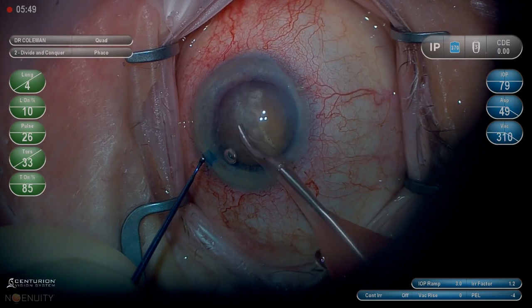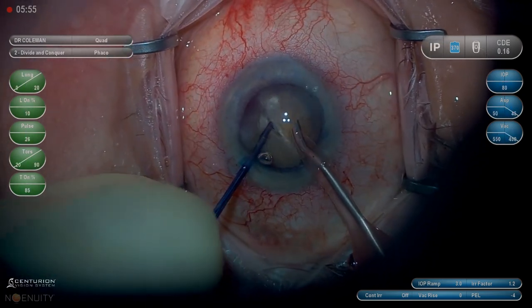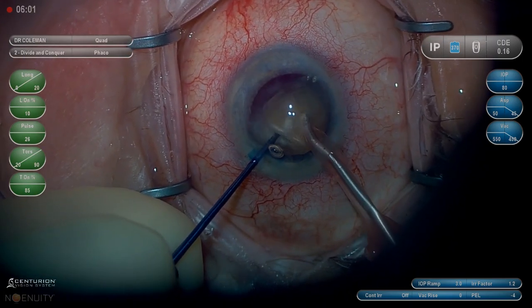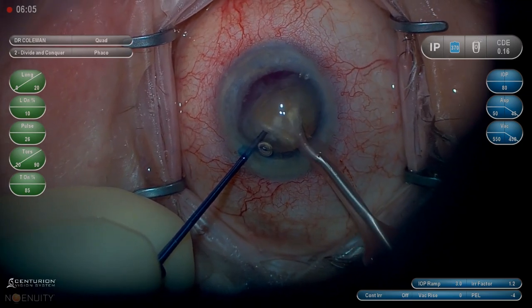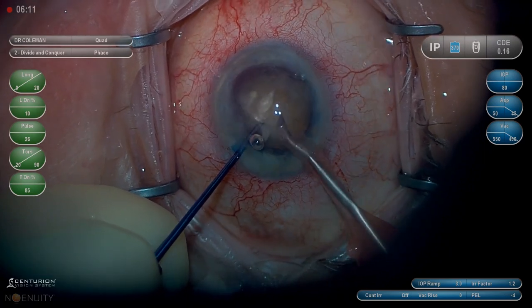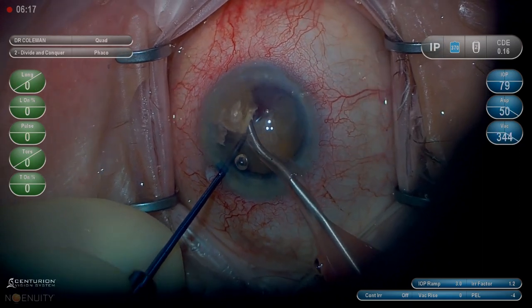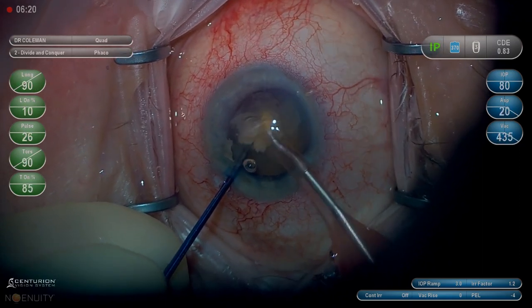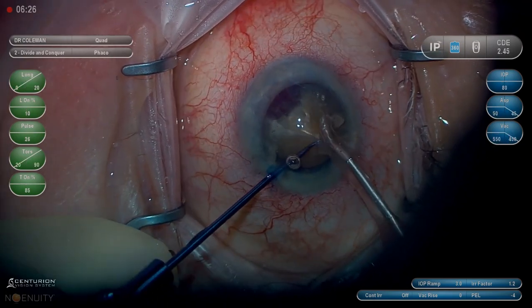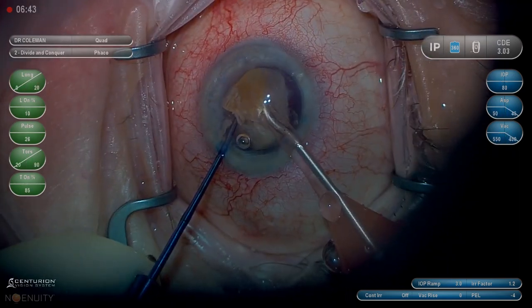Here we're in Procedure 2 on the Centurion for a divide and conquer. I use essentially the same technique of breaking the lens into quadrants, whether I groove it with the phaco or whether I crack it in half with the miLoop. You can see we break off what is almost a perfect quarter. I believe this is the most efficient way to remove the nucleus in a consistent way, whether it's a dense lens or a very soft lens. We'll bring the second quadrant up into the anterior chamber and actually break it into a slightly smaller piece since the lens is extremely dense.